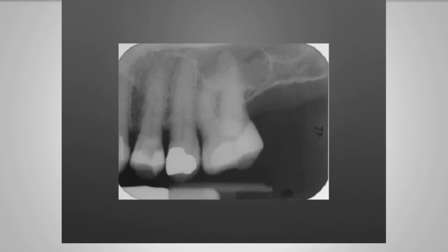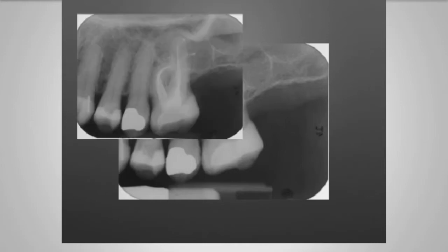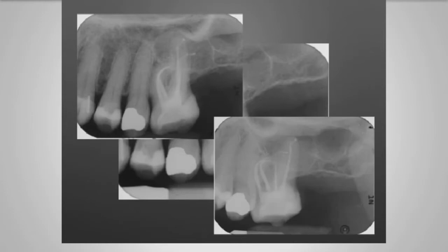So this case is quite interesting. You look at the plain view using the rinn holder and you can see that yes, there's two mesiobuccal canals as we'd anticipate, and they do go around almost a 90-degree bend. But it's quite fun sometimes with these cases to look at the view that you don't always see. This is a distal angulated view, and you can see that the MB2 canal actually flips around and does more than 90 degrees. So it's a challenging case.